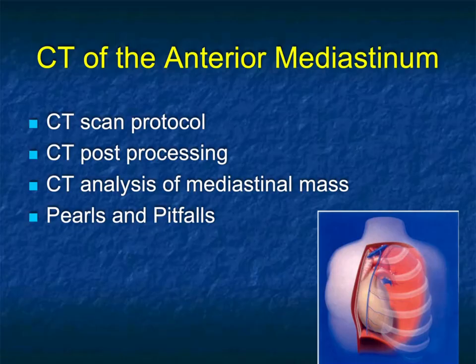Occasionally, you'll do dual phase acquisition, perhaps in certain patients where you're worrying about vascular processes and trying to optimize venous and perhaps the arterial mapping. Perhaps there's a question of a possible thrombus in the heart or in the SVC or pulmonary arteries, and you're not exactly positive. But in most cases, a single phase acquisition works very nicely.